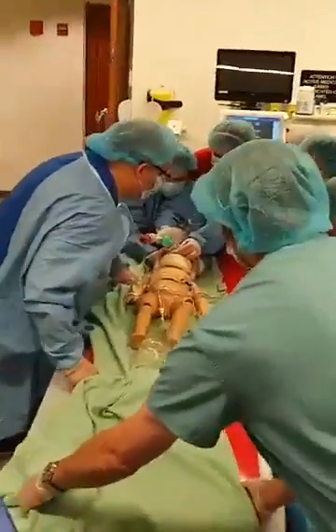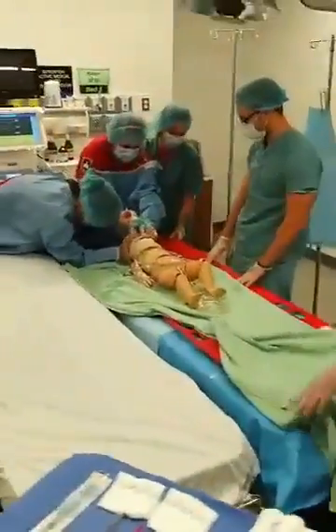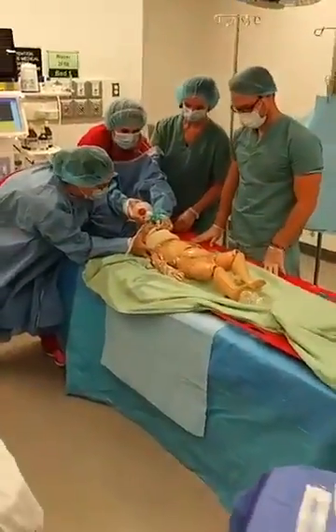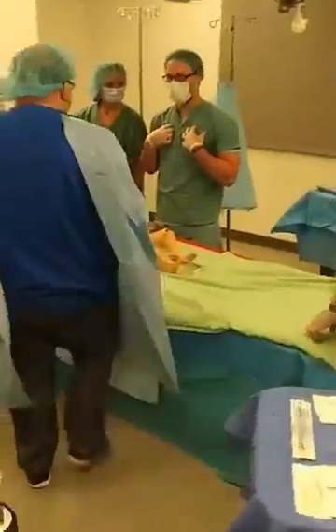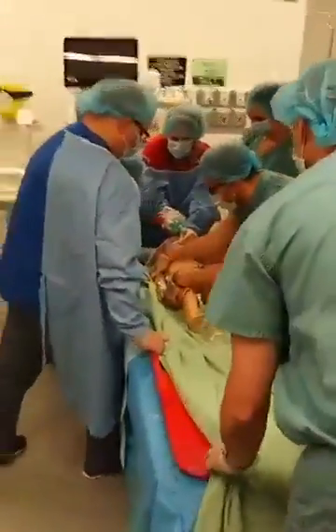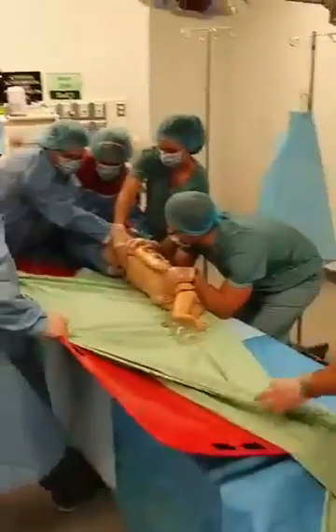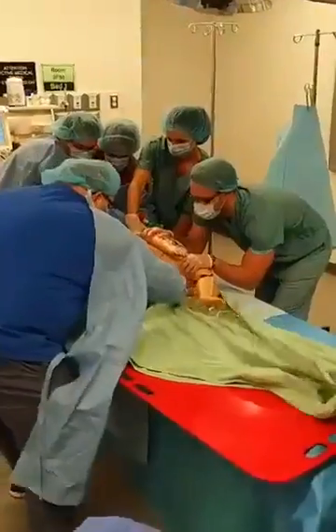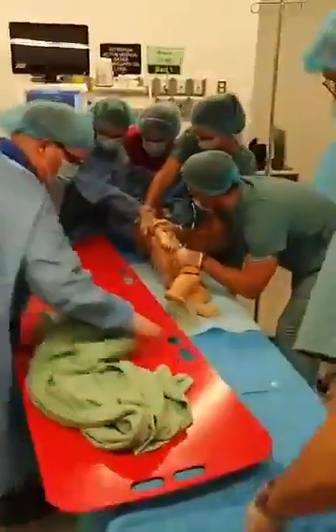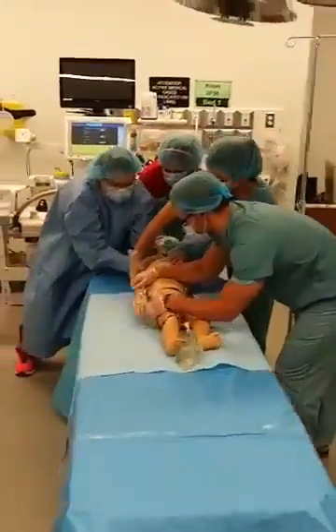3, 2, 1. Slide. Good. Great. Just slide that out. Are you okay there? Whoever's doing C-spine, when you're ready, you're going to call the shots. I'll be the one that rolls. I'll pull the board. 3, 2, 1. Forward. Got him. Right here. There you go. 3, 2, 1. Good work, team.